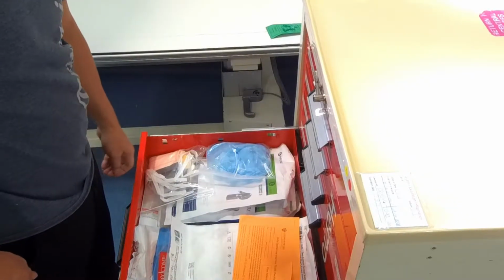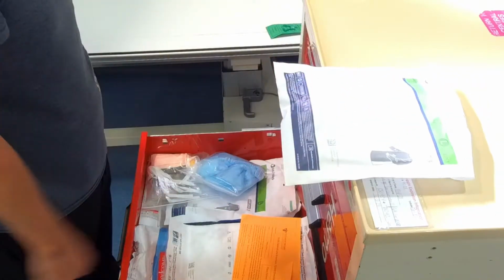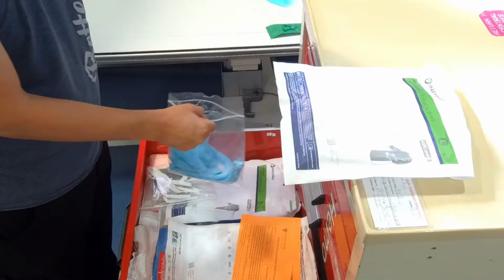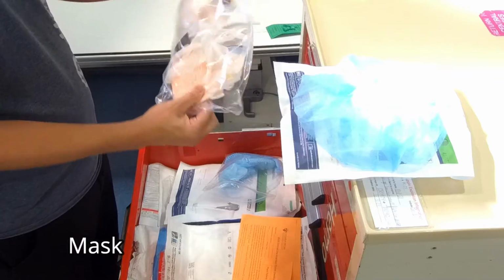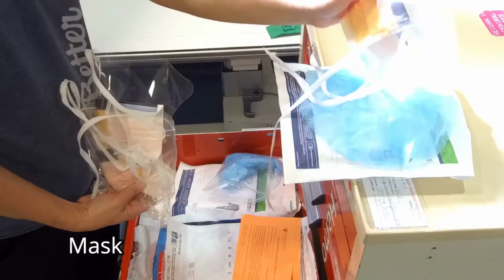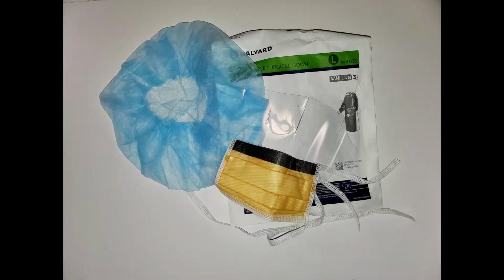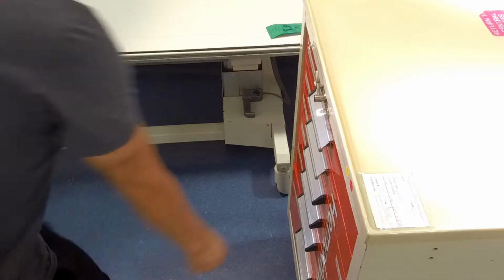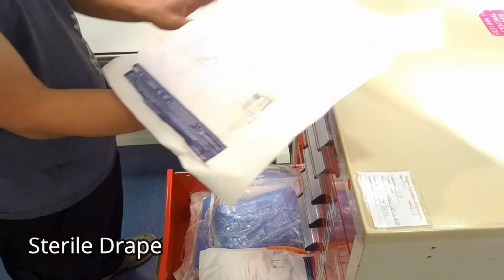On the fourth drawer, you're gonna need a gown, a cap, a mask. Last drawer, what you're going to pull out is a drape.